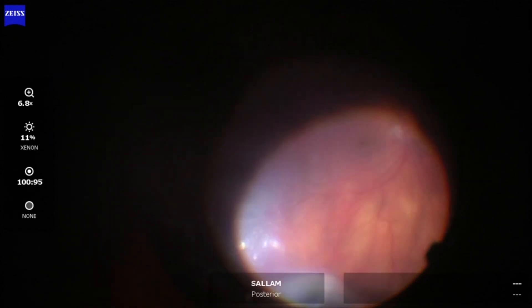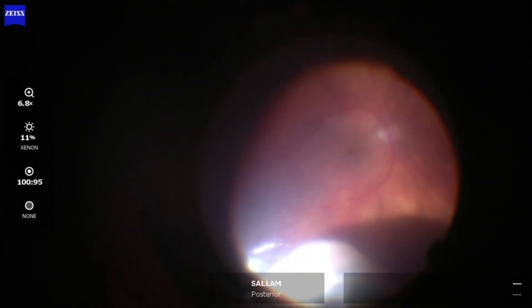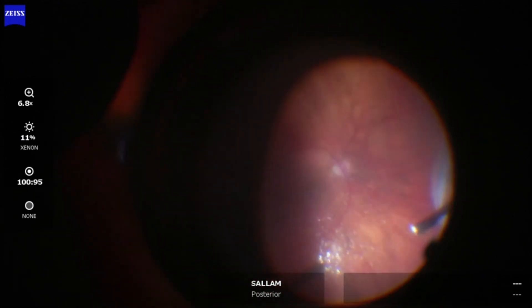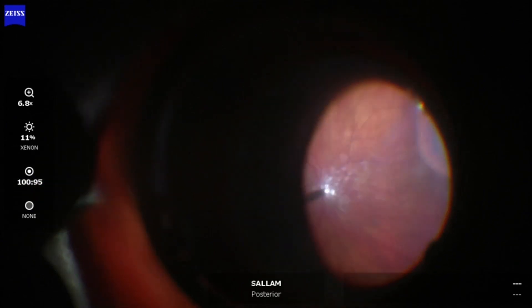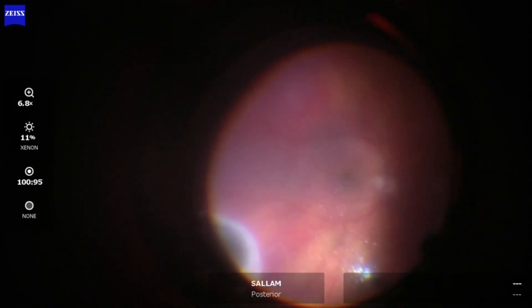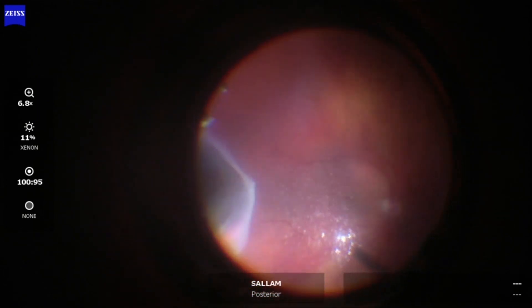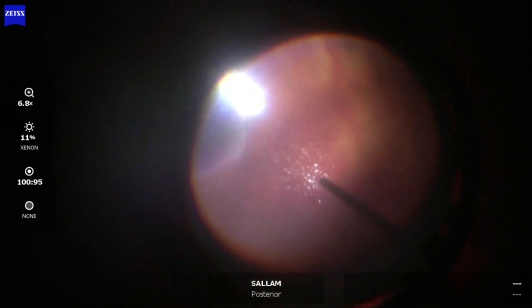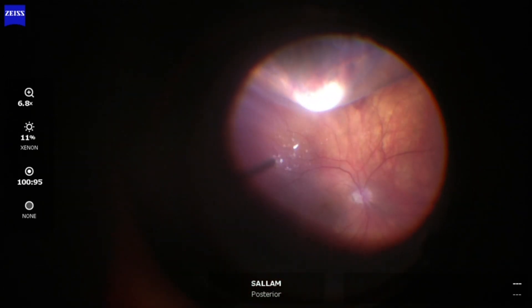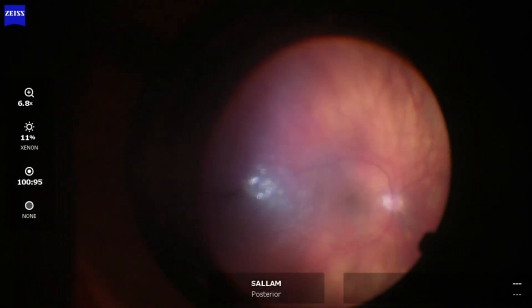After finishing the vitrectomy, scleral indentation with endoillumination is performed to look for retinal tears. One side of the retina is indented, carefully searching for breaks. Here there's a break in attached retina at 6 o'clock. Now switching hands and indenting the other side. This is the main break and no other breaks are otherwise found. This break is treated with cryopexy, but could also be treated with laser.